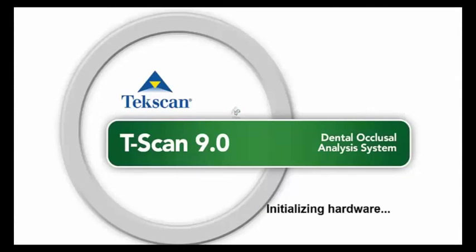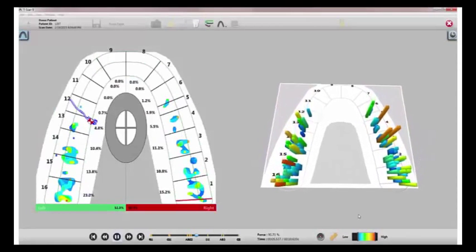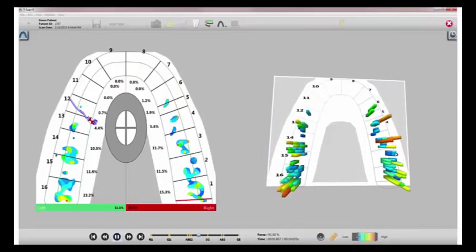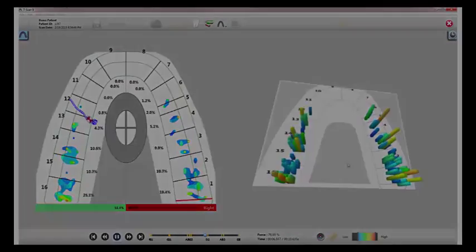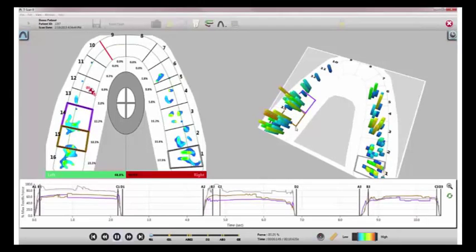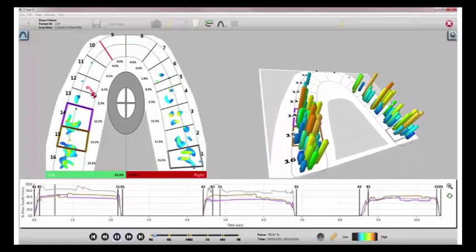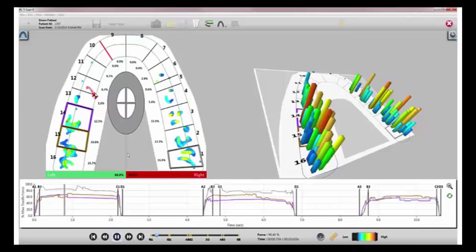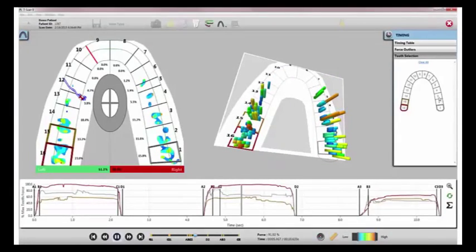T-Scan is a state-of-the-art digital occlusal analysis system that provides dynamic occlusal measurement. Software version 9.0 gives dentists comprehensive data to better understand and diagnose patients' occlusal issues. Features of the software allow dentists to analyze the forces on the teeth, making it easier than ever to identify premature contacts and loading pressure.